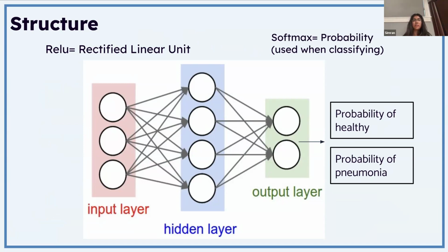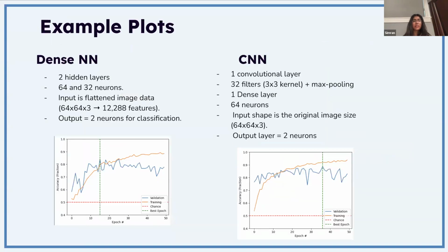We used two new activation functions, called ReLU and softmax, which in the end should calculate a probability for a diagnosis. Neural networks can be useful for a wide variety of tasks, while CNNs include convolutional layers before the neural network, which help with feature extraction and enhancing what we're feeding into the neural network.